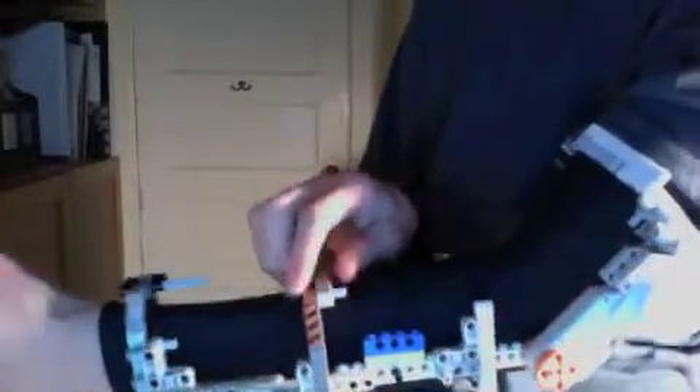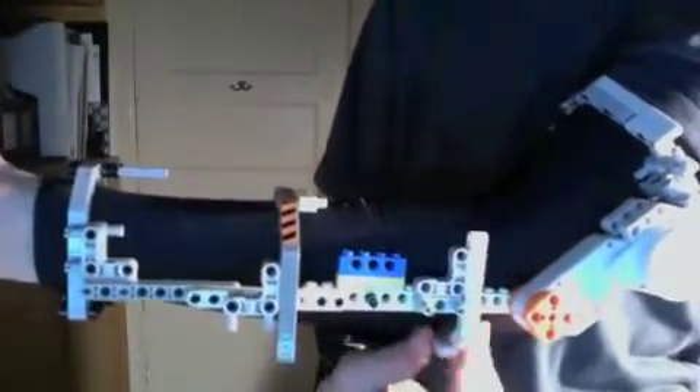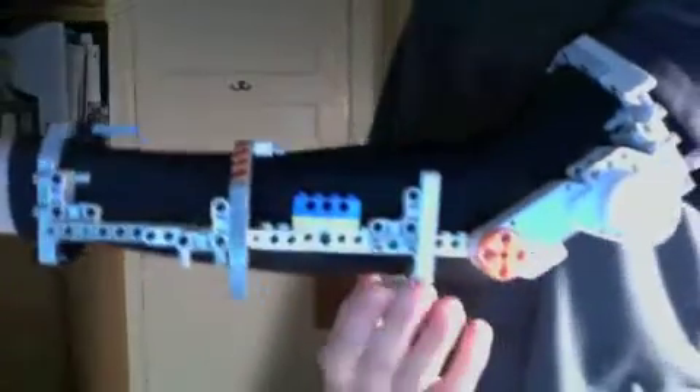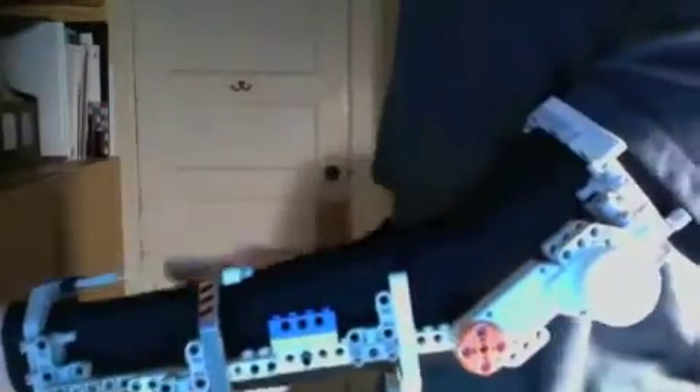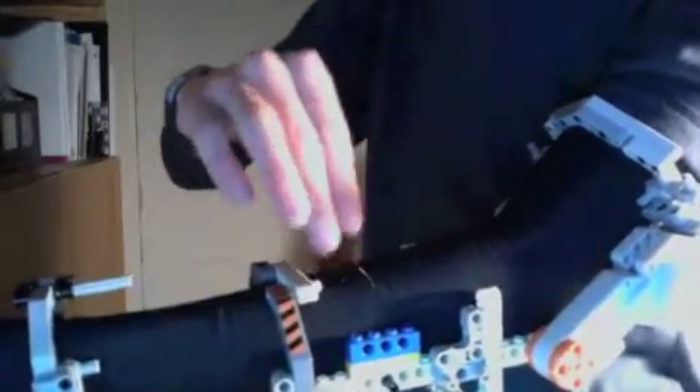So this is kind of arm mark two. I've added a couple things. I've added this brace right here because in the first one it was a little bit loose. So this brace is just a little piece underneath that covers the bottom. I've added another one up top. I decided I wasn't going to do a third piece that goes all the way around, so I added one on top, one on the bottom, which still leaves room for the two sensor things that are going to go up here.